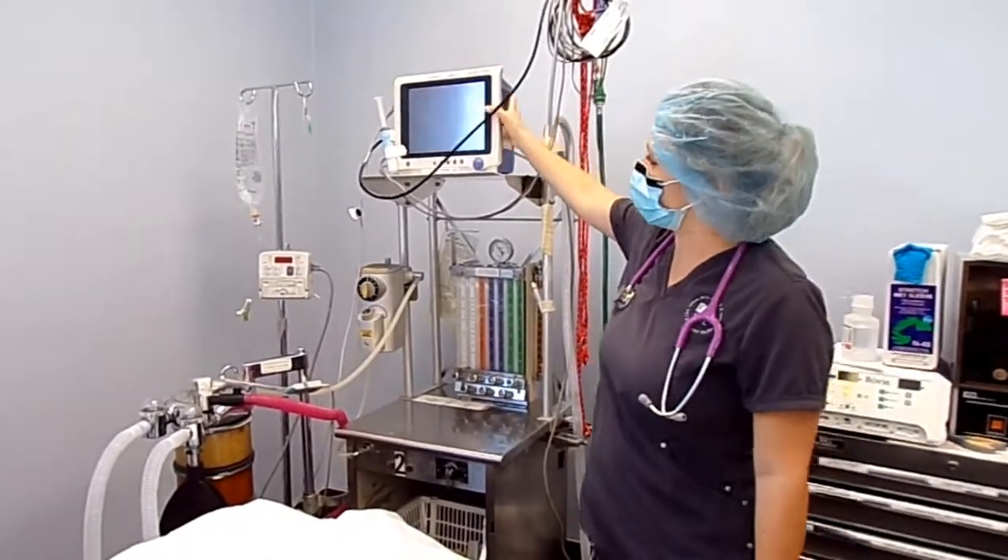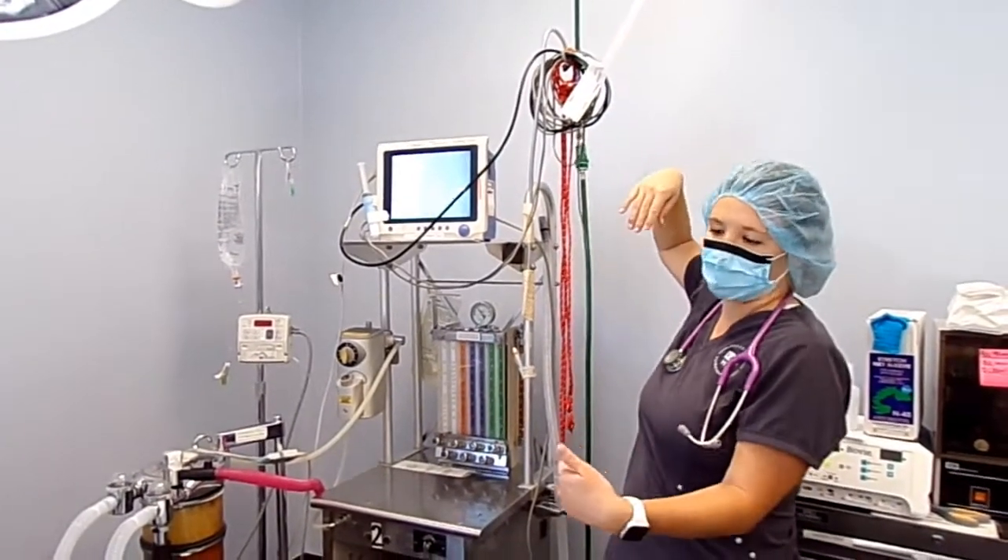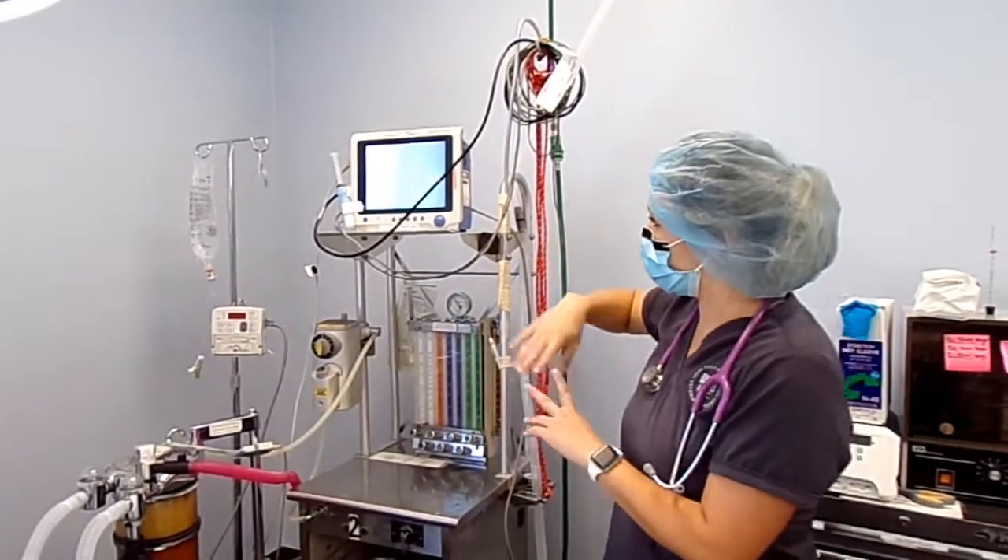Here is our monitoring machine. We have all of our leads hooked up right here. Once we get the patient in we'll get them connected and then get our monitor running.